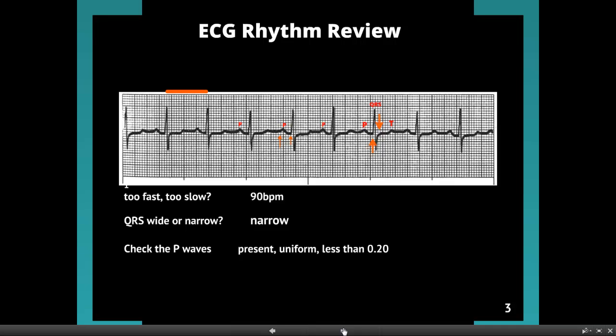The QRS being narrow tells us that everything's okay south of the AV node — the Purkinje system's working great, and we've got a good contraction of the ventricles. The P-wave tells us that the SA node is in charge. We name rhythms after where they originate, so this is going to be a sinus rhythm. It is 90 beats per minute — not too fast, not too slow. Above 100 would be tachycardia; under 60 would be bradycardia. But this is a normal sinus rhythm.